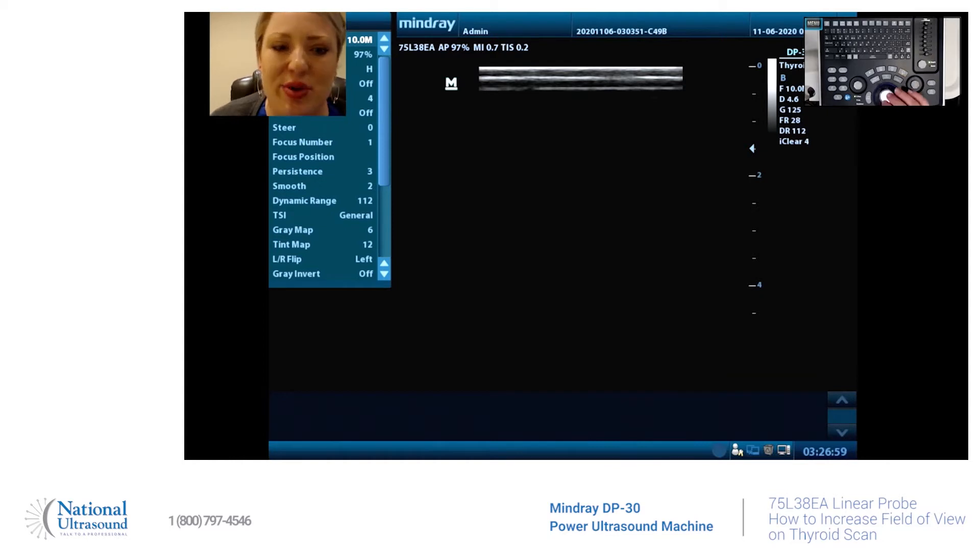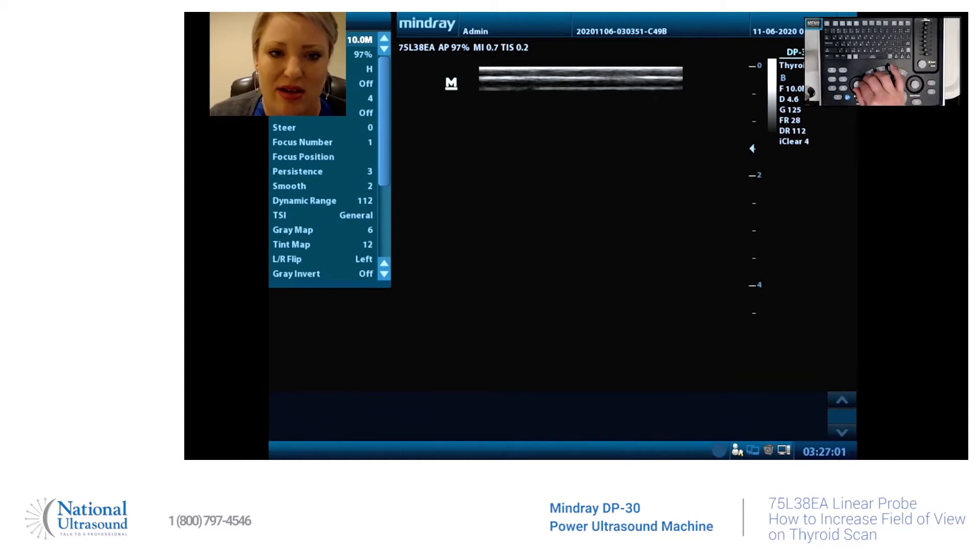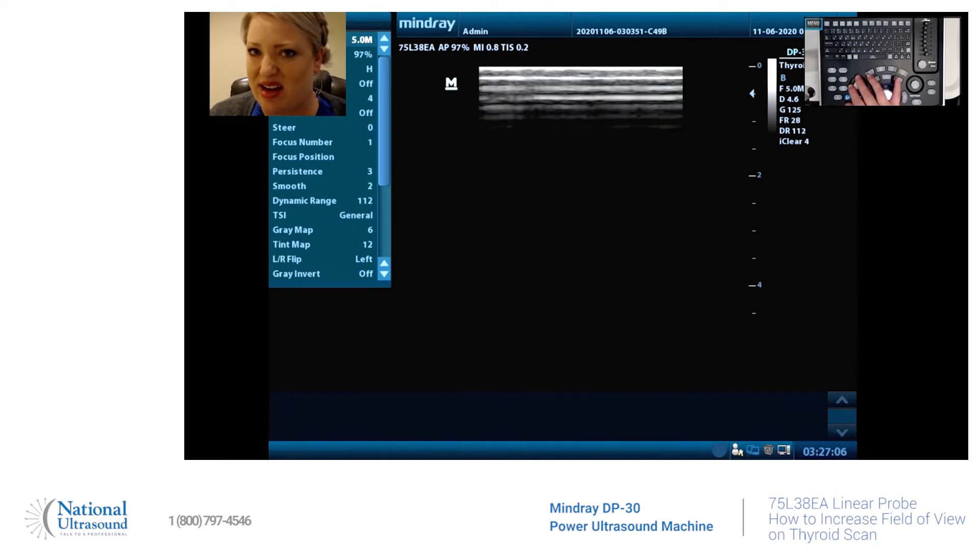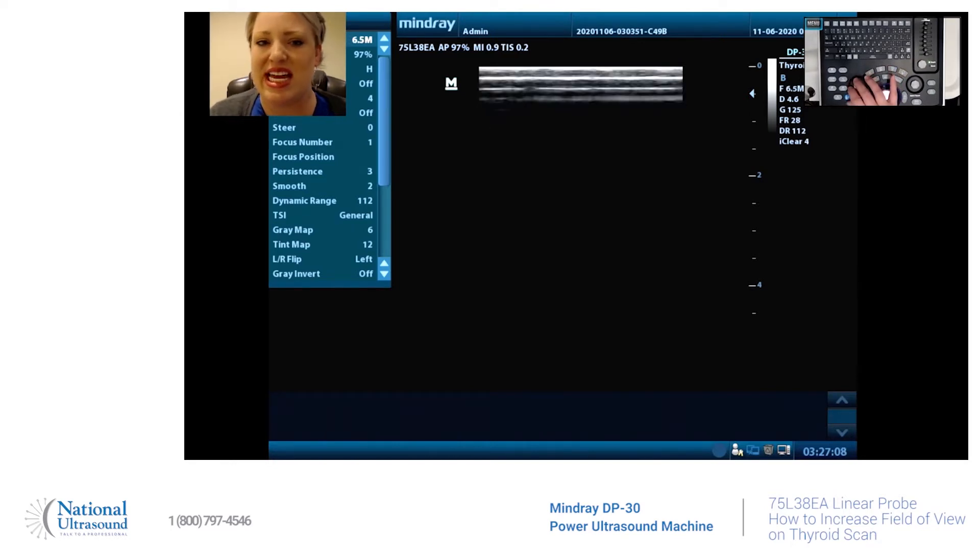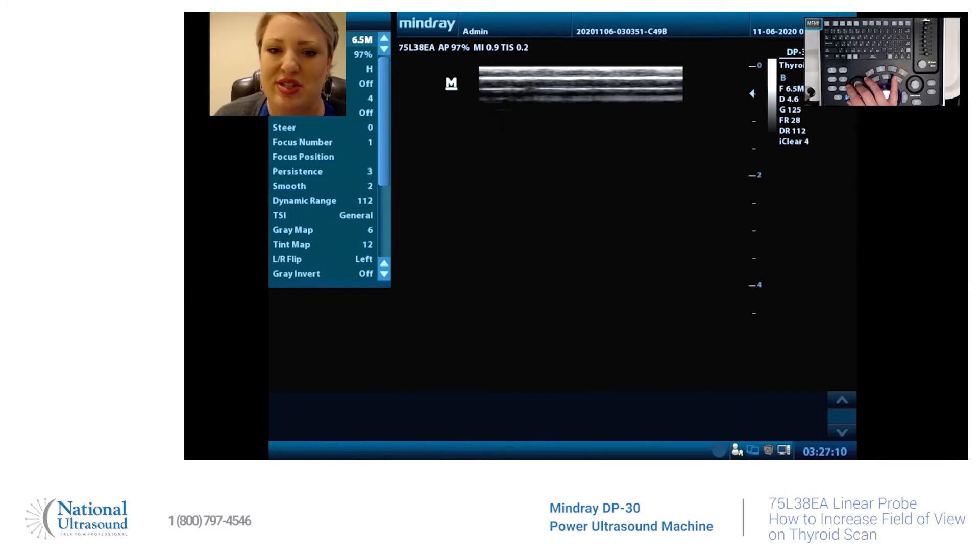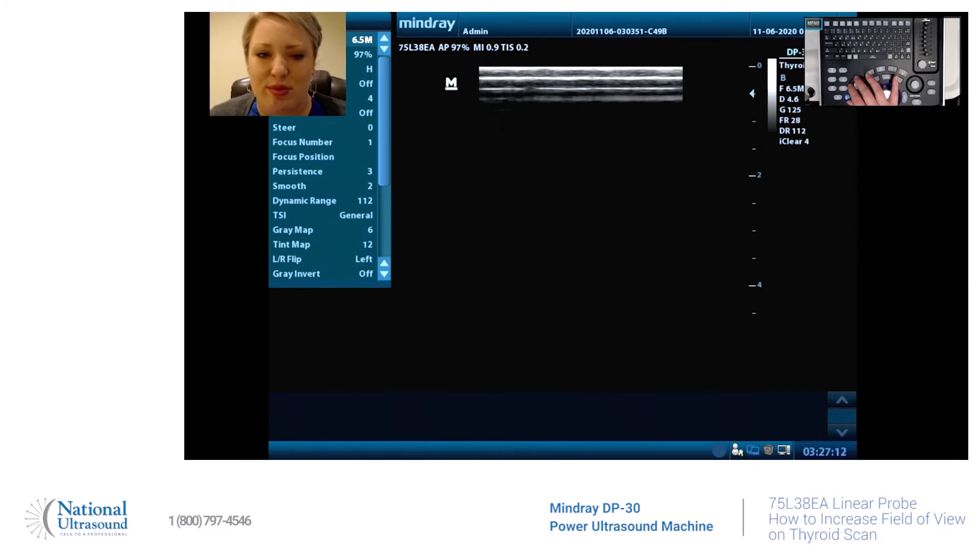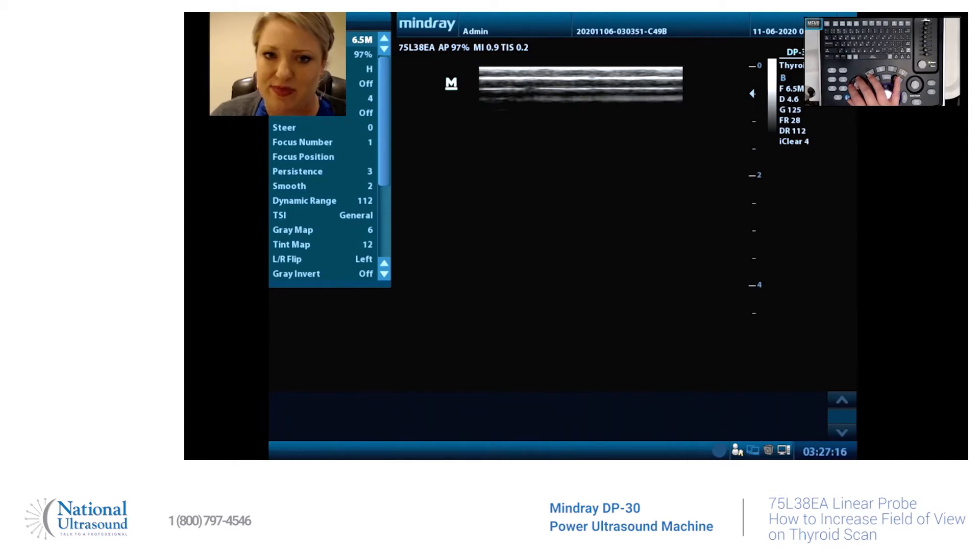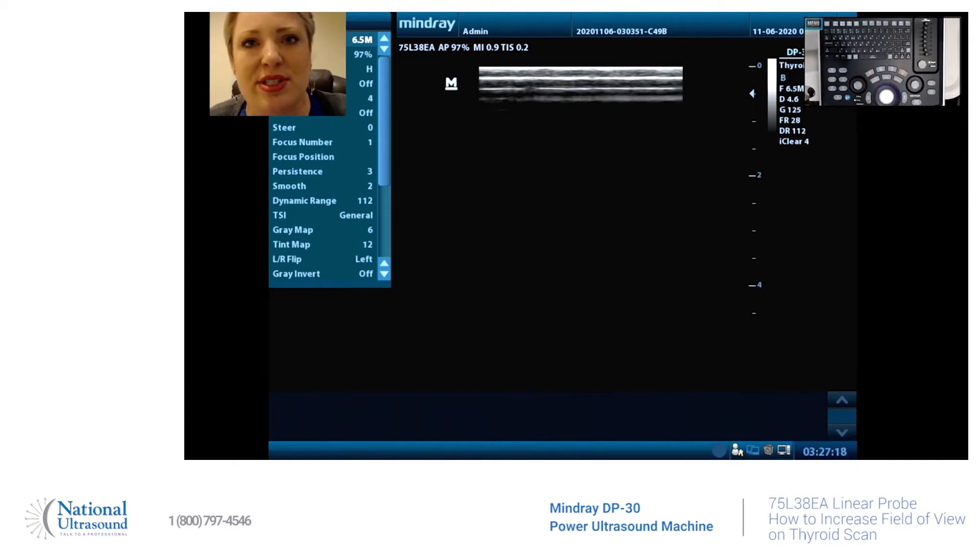It has a frequency range of 5 megahertz to 10 megahertz fundamental. We also have harmonics that is 8 megahertz and 10 megahertz.